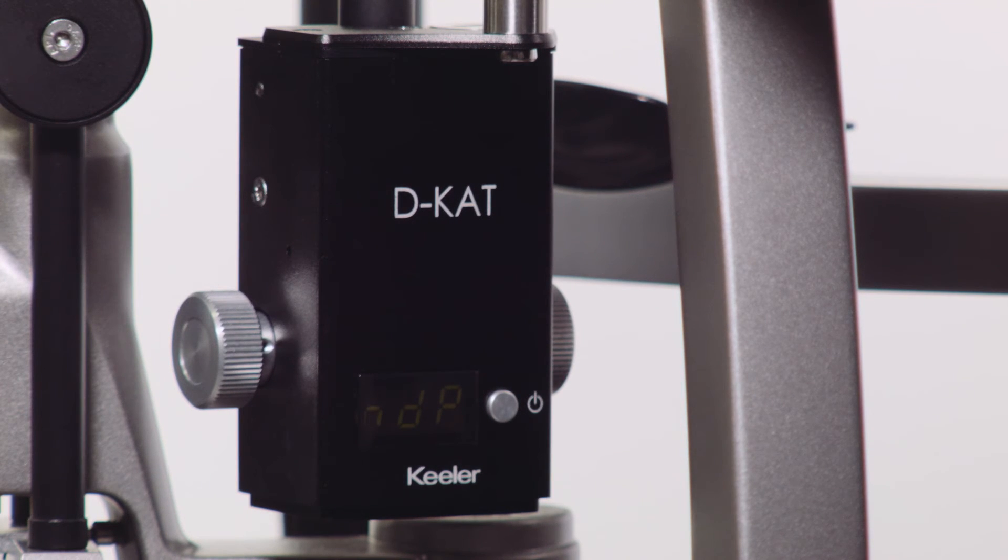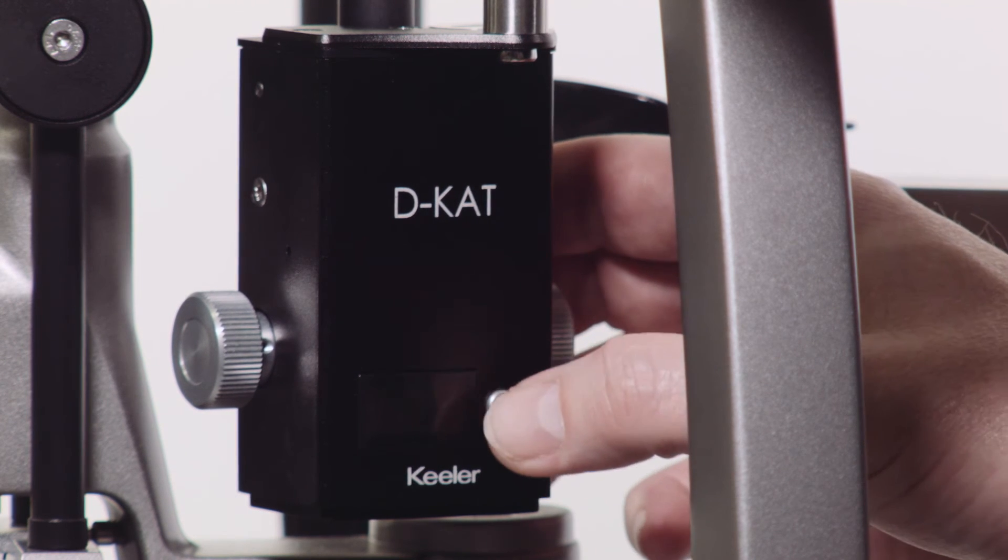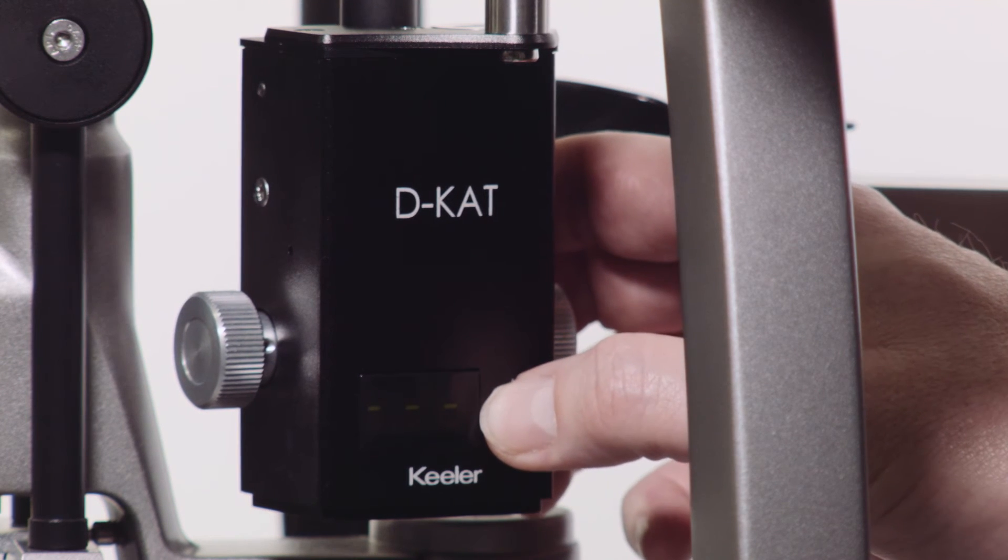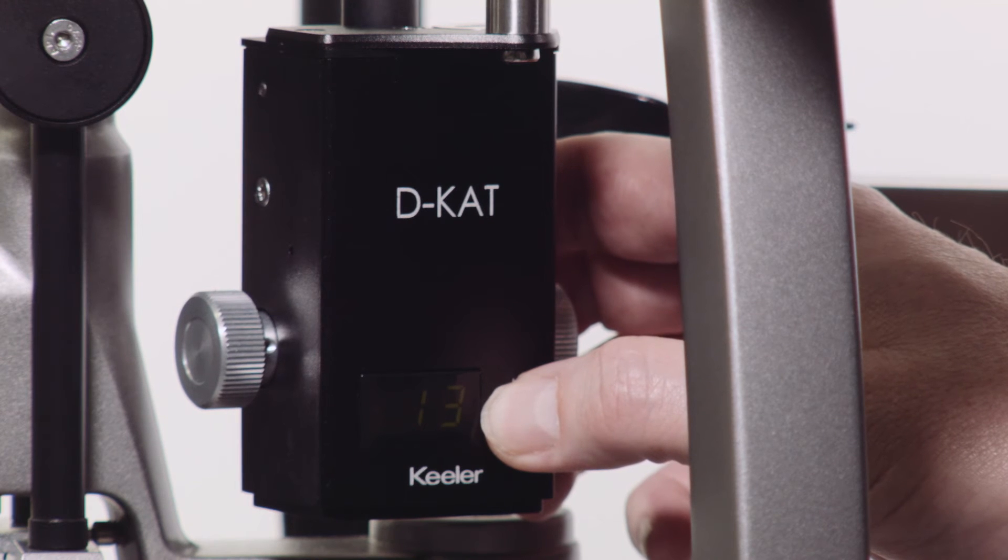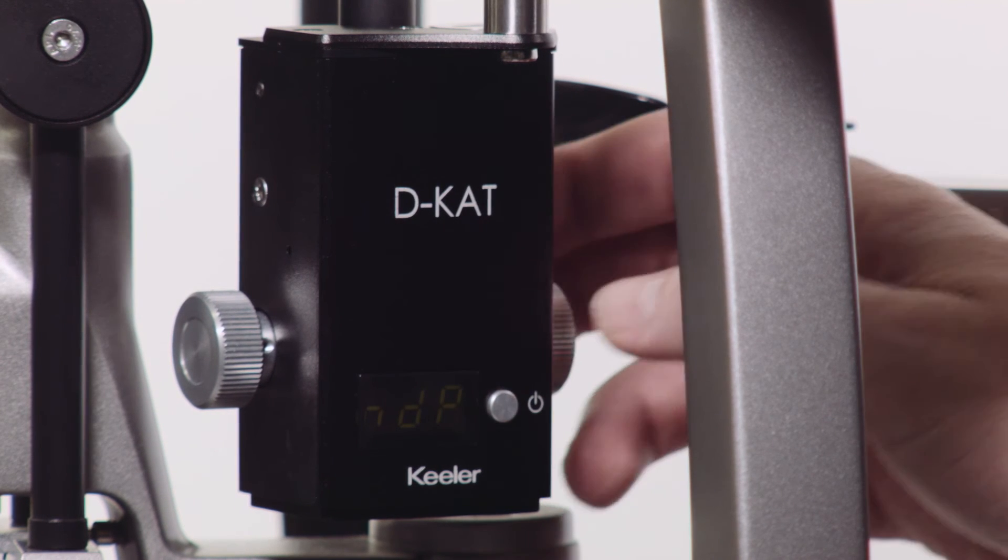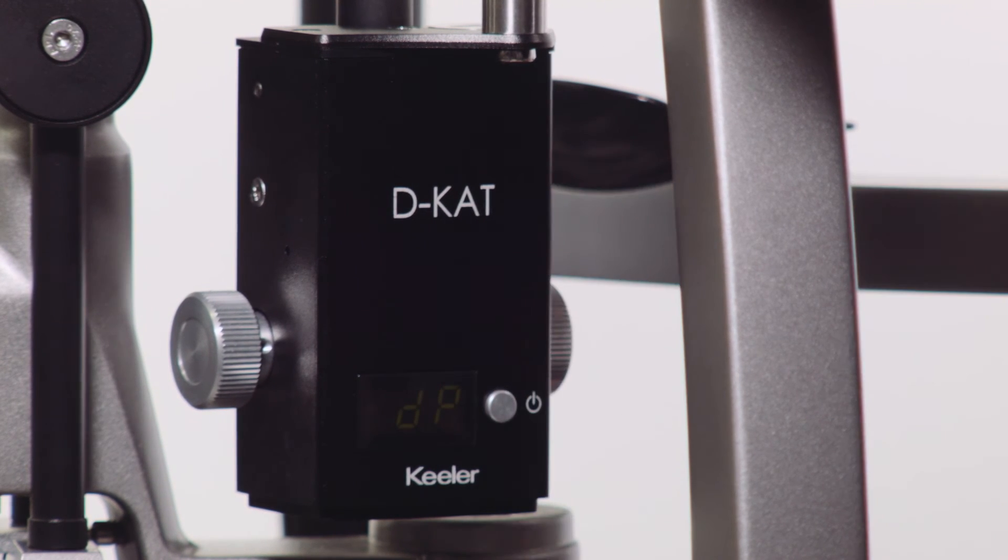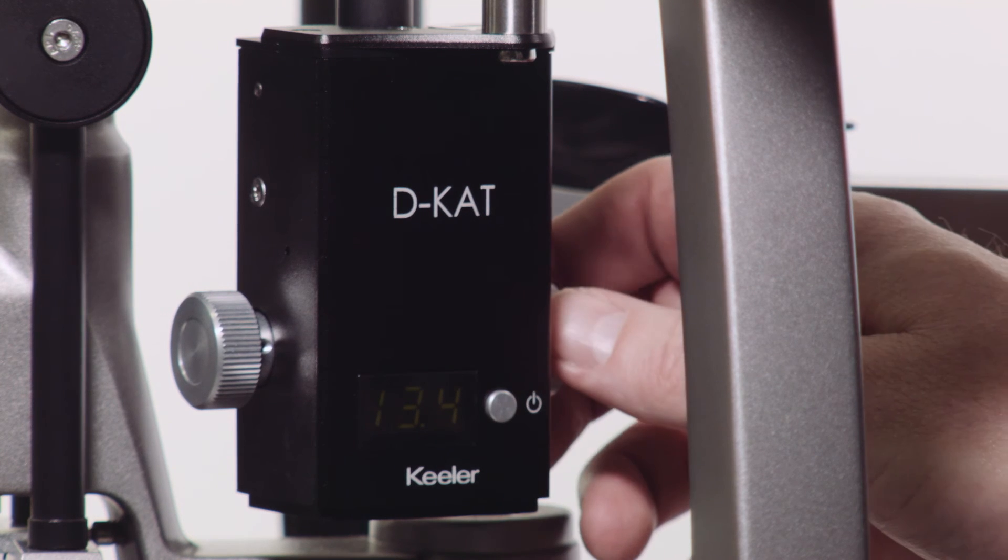press the function button for three seconds, then release the function button. D-P, or decimal point, and N-D-P, for no decimal point, can be toggled with the function button. Release the function button to select the desired setting.